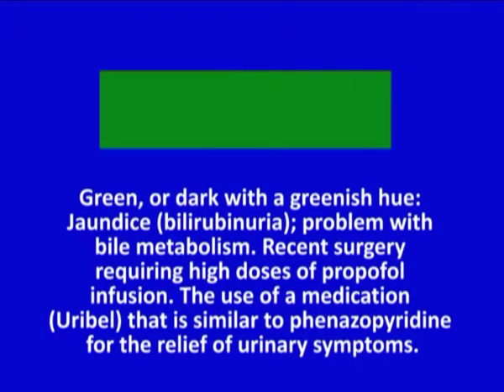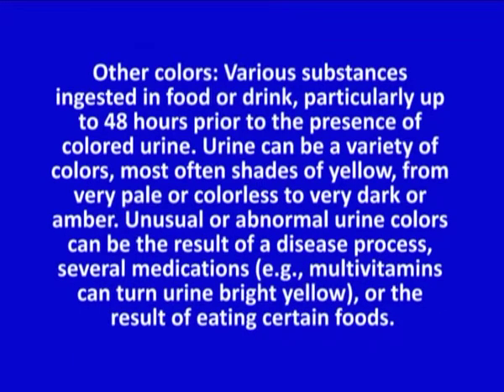Green or dark with a greenish hue is an indication of jaundice or bilirubinuria, a problem with bile metabolism, recent surgery requiring high doses of propofol infusion, or use of a medication similar to phenazopyridine for the relief of urinary symptoms. Other colors: various substances ingested in food or drink, particularly up to 48 hours prior to the presence of colored urine.